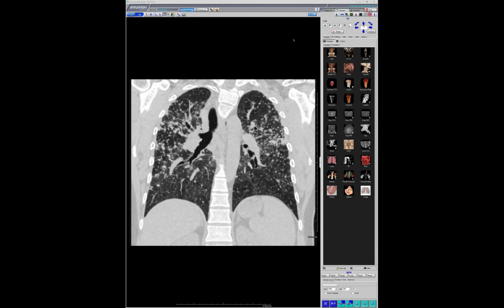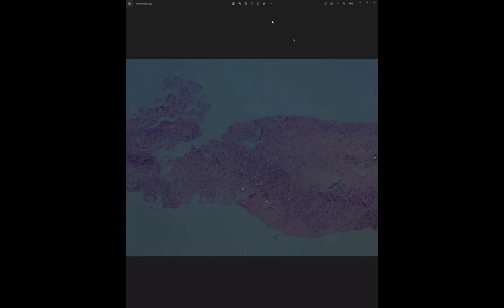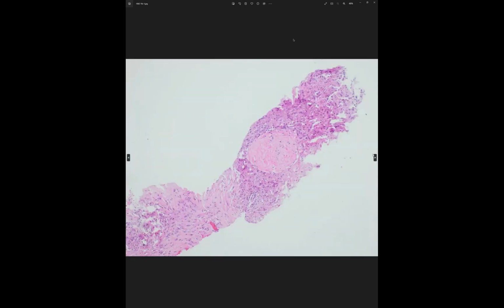So here is his path. They did a biopsy, even though we're like, yeah, this is silicosis. You can see here's all the polarized material, because obviously sarcoid's in the differential, but we had the history. And then here's a beautiful silicotic nodule. And this is from a cryo. So this is one of the nicer cryos where you get a nice silicotic nodule.